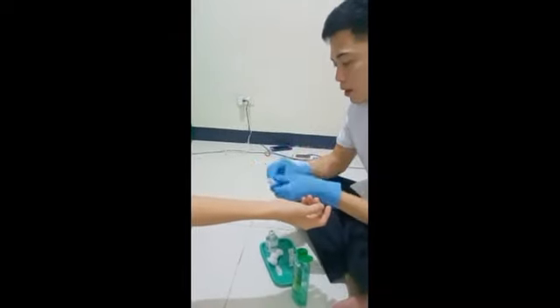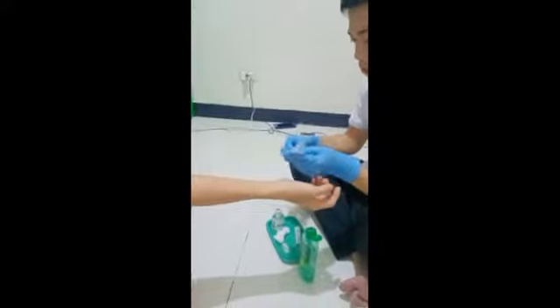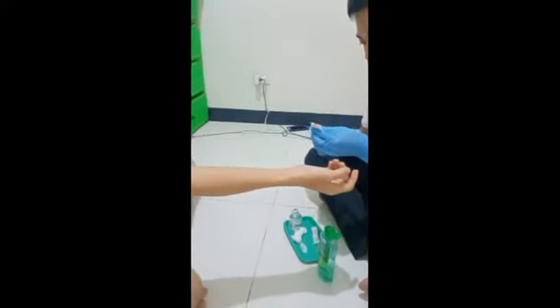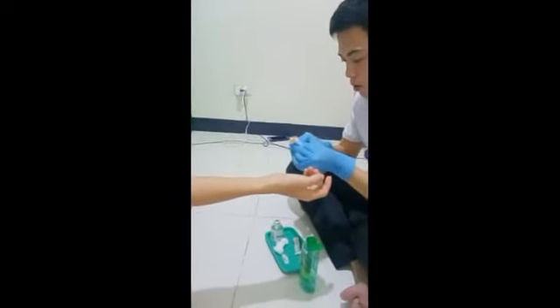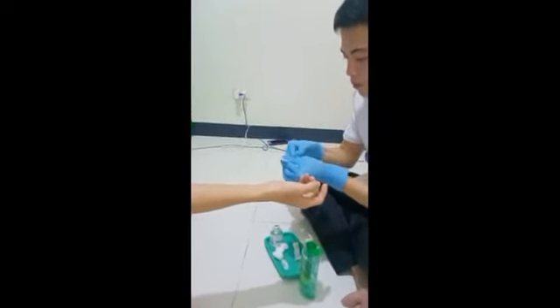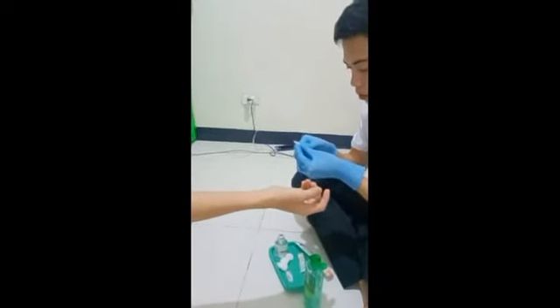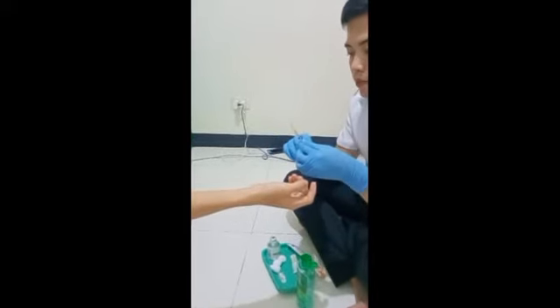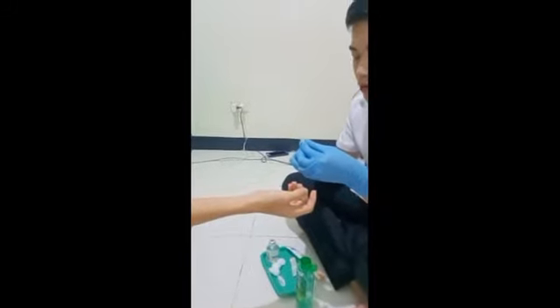So inject. So you need to check the bevel of the syringe.